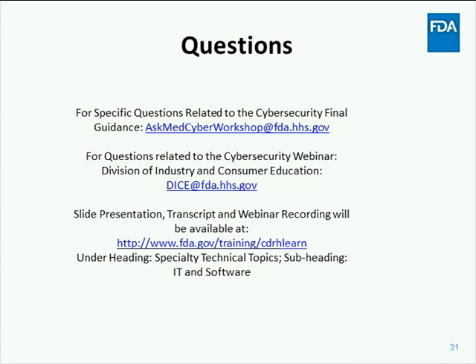Our last question comes from Joanna. Ma'am, your line's open. Hi, good afternoon. My question is in regards to the scope as the guidance applies for mobile medical applications. Can you talk to whether the scope applies to medical applications that fall under enforcement discretion? Hi, this is Steph Parmity. I believe the mobile medical applications that fall under enforcement discretion are still classified as medical devices. Therefore, those would be in scope.